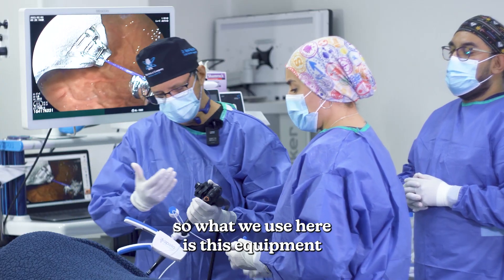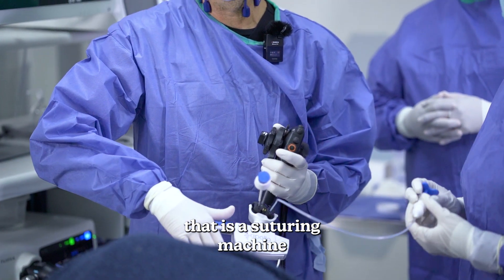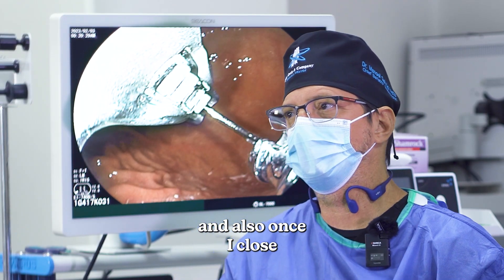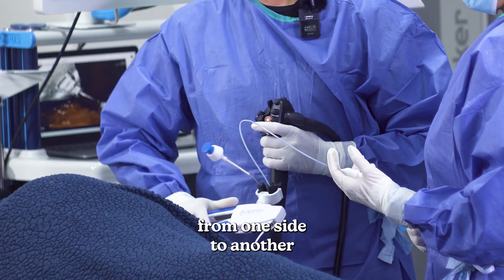What we use here is this equipment that is a suturing machine. You see here, when I can open and close, there is a needle inside. Once I close, I can exchange the tip of the needle from one side to another.